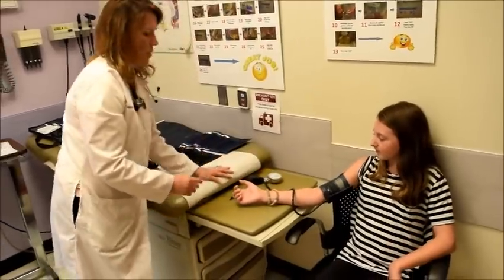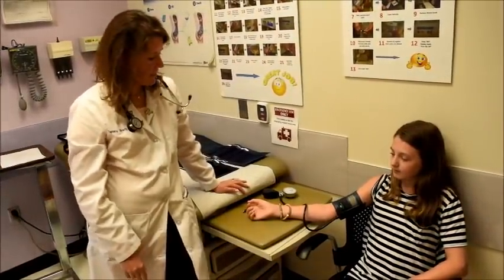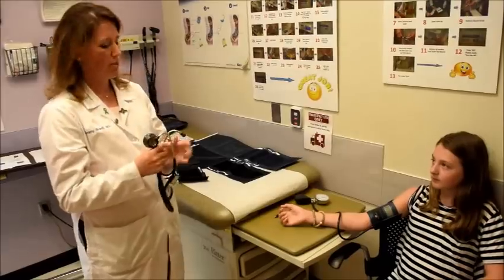So when you add 30 to that, that is 120, and that's going to be your peak inflation level. Okay, so we're going to let our arm rest, and we are going to get ready to take the measurement.